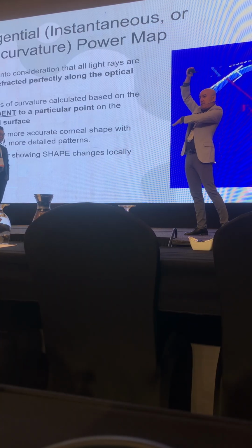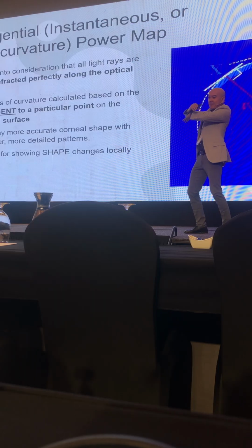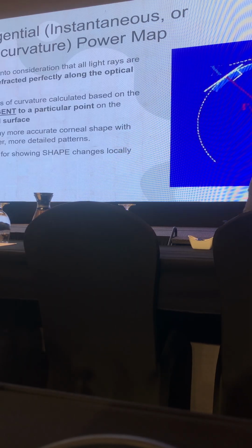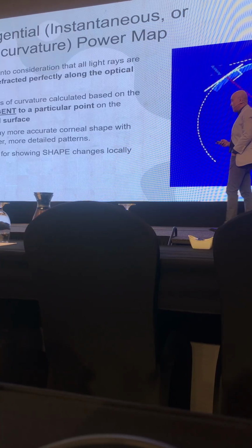Superman flies and then just lands on the ball. Big ball, that's the tangent. Tangent is very important. We know where the lens is, that's actually the relationship. It lands on the point.